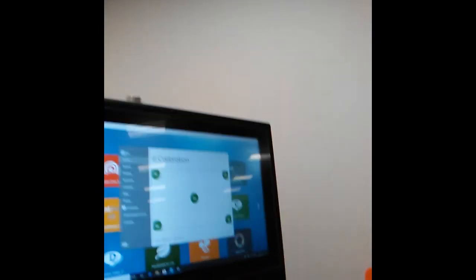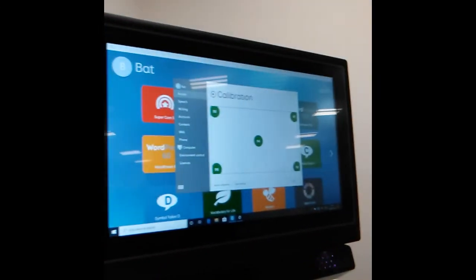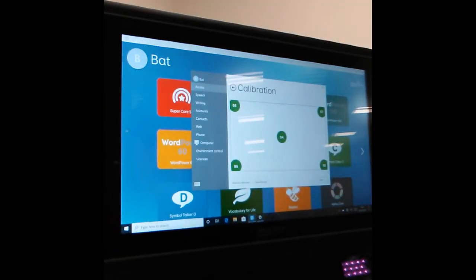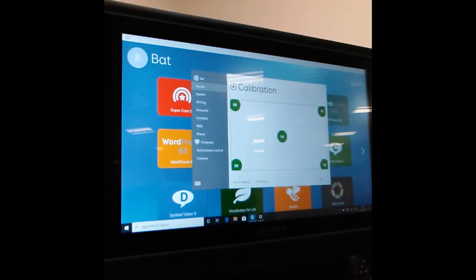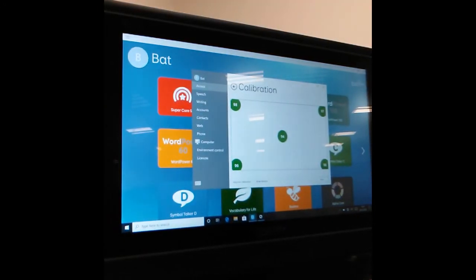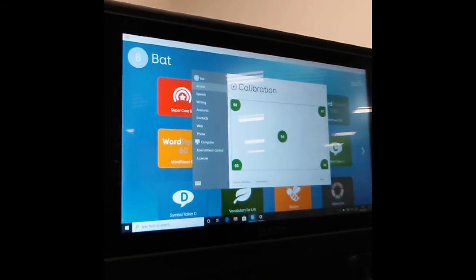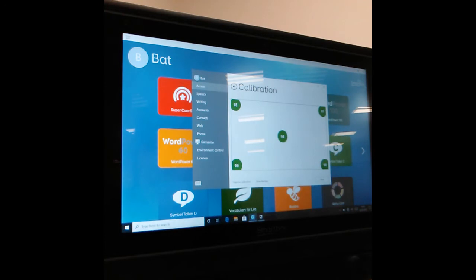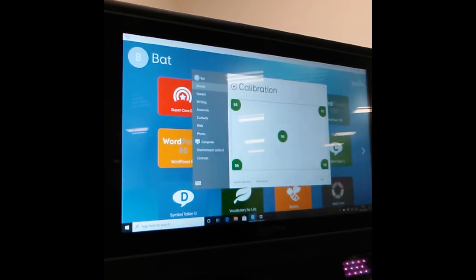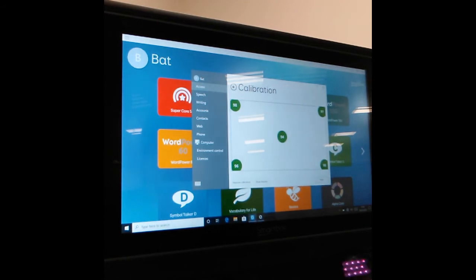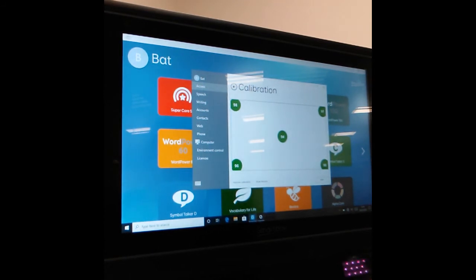You will then get a score. Because they are all green, that means that it's calibrated fairly well. Sometimes that can differ but it still would work fairly well for the client. If it is red, that usually means it's not a great calibration, but it might still work so it is still worth trying.